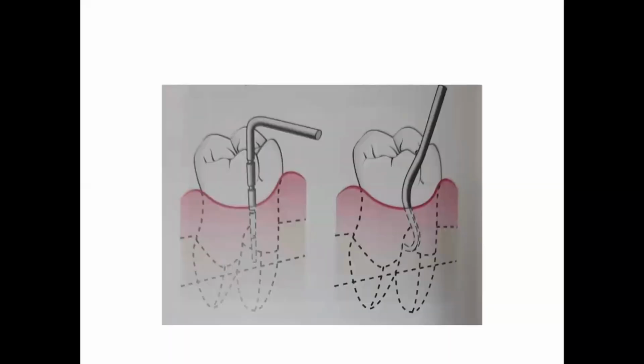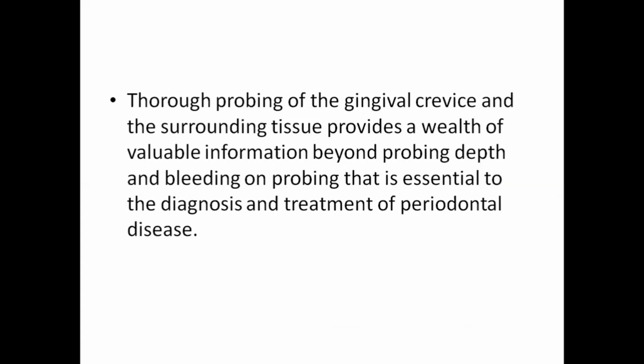And the last is furcation involvement. In furcation involvement, you have to take into care both the vertical and the horizontal axis of the furcation. The vertical is to be noted with the normal probes, while the angulated part can be probed with curved probes like Nabers probe. This covers all of the probing: what probing depth is, how the probing is done, what factors are taken into care, what the probing force is, and what things are taken into consideration.